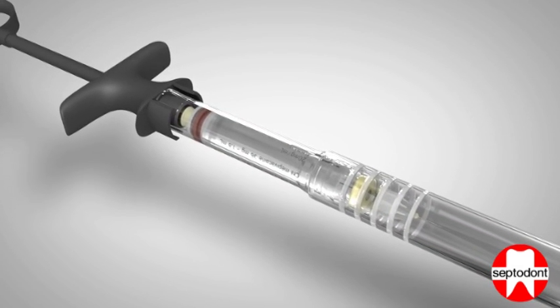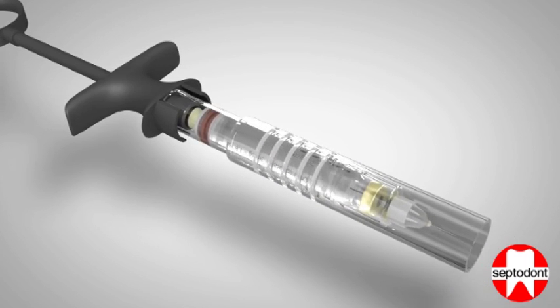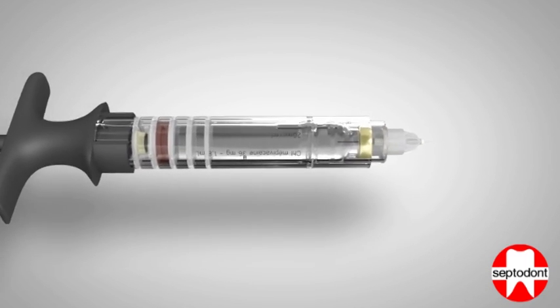When the device is required to complete the injection procedure, carefully slide the protective sheath back to expose the needle, as in Step 3, and continue the injection procedure.